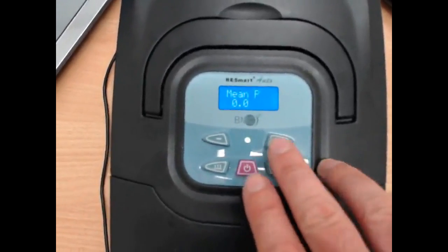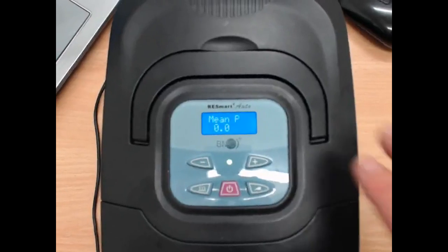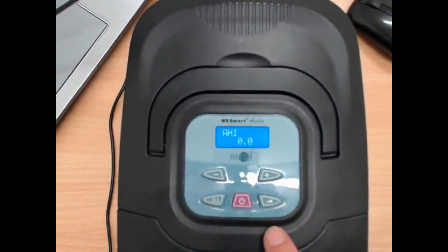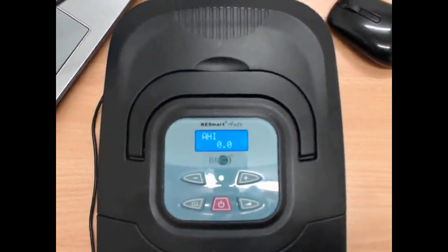Then we can press plus, gives us an average pressure once again. So all the pressures averaged out over the whole night. Where's the average? What's the average at? Then it's got your all-important apnea-hypopnea index. So this is how many times an hour you're having any breathing episodes.